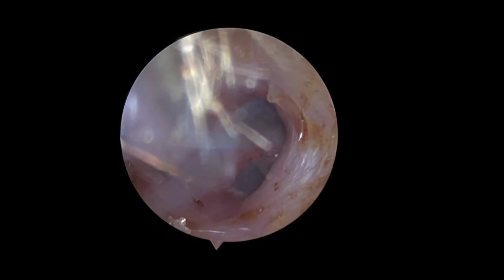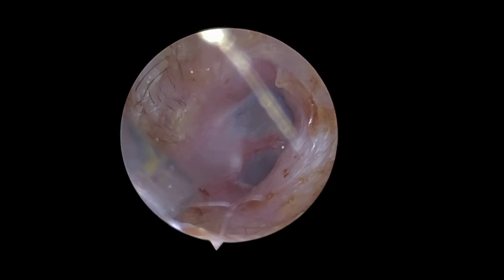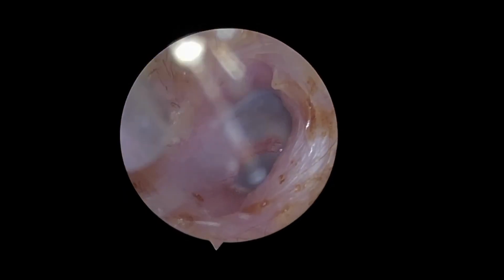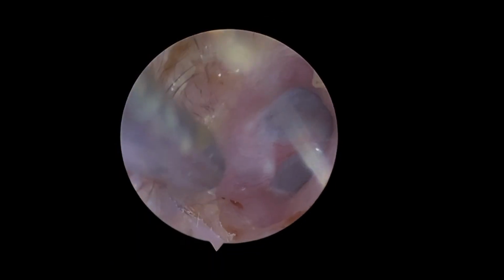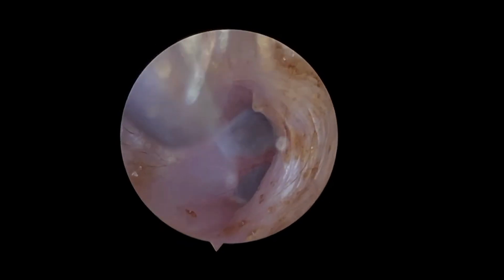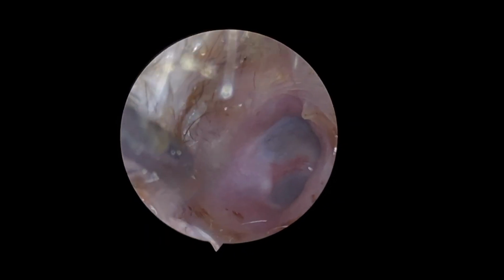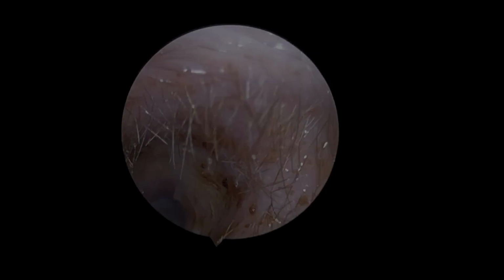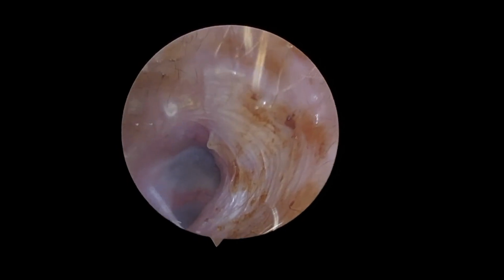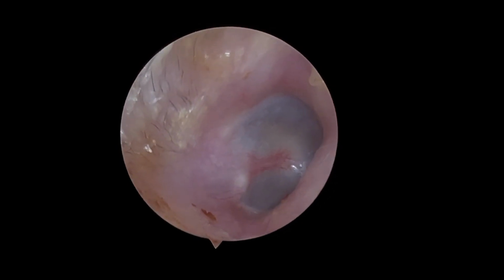But I think probably due to operations of polyp removal which he's had, perhaps the skin producing the hairs was somehow pulled over to cover the scarring as part of the healing of the skin. Either way, however it got there, it's very unusual to see. You can see here that the hair extends almost up to the eardrum. And we have a final shot of the eardrum here. Good job, I would say, and a normal looking eardrum.